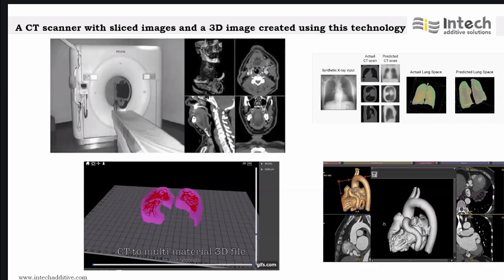It's not only the lung that you capture; it's also the neighboring regions. So you basically have to segregate it, segment it, and then you have to come up with this particular model. There are softwares that help in doing it. For example, you have softwares like Materialise Mimics, 3D Doctor, Amira, Simpleware, and so on. And if you want a free, open source software, then you can go in for a software called 3D Slicer. Anyone can use it for free.